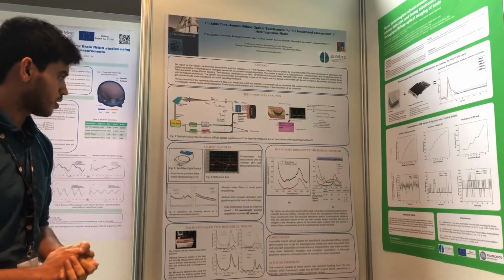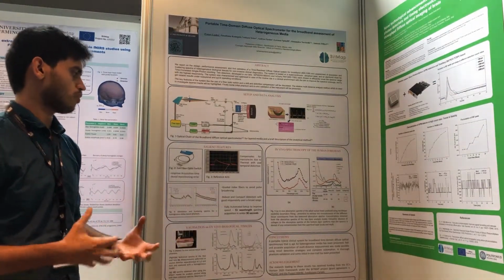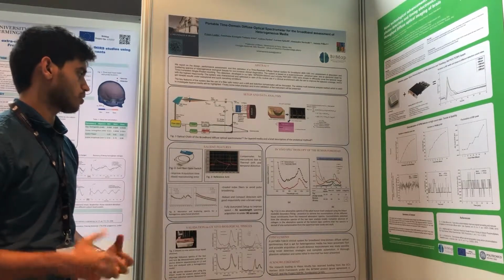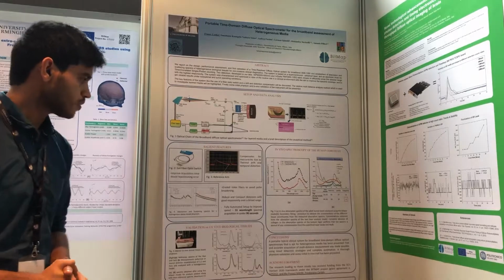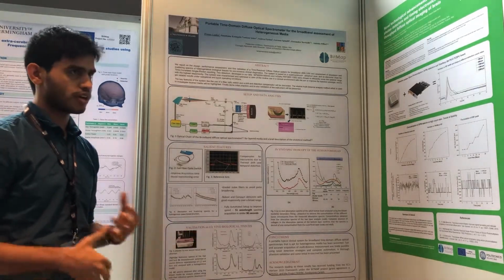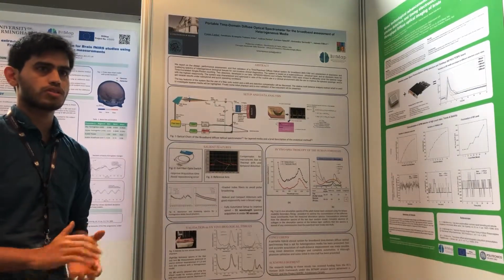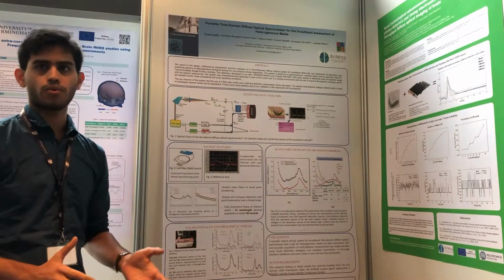And some other interesting features: the use of graded index fibers on the source side to avoid pulse broadening. Then the robust and compact detectors, which are again very useful in the clinical scenario. Just to give you an idea of how fast the system is, a typical acquisition of a 51 wavelength broadband measurement takes about 1.5 minutes.